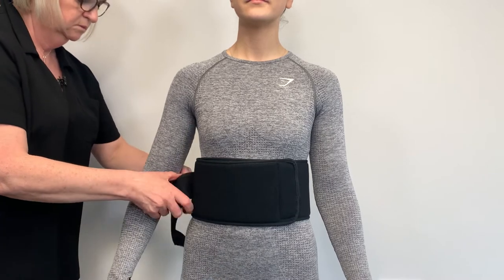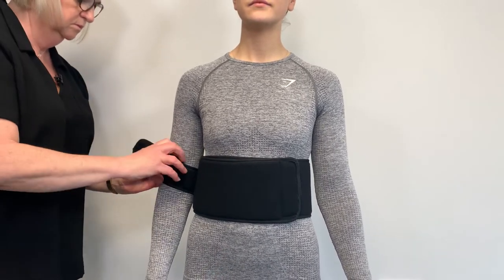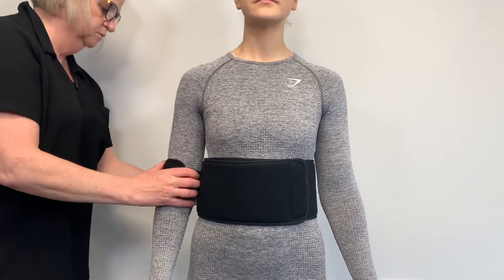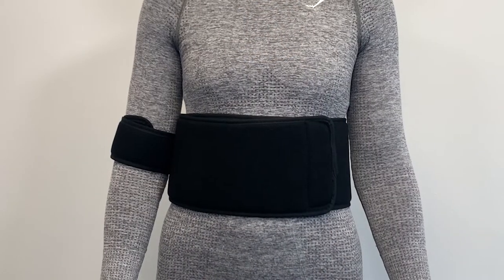Wrap the humeral band above the elbow and gently tighten. Continue to adjust both the swathe and the humeral band so that the affected arm can be maintained in the desired position.